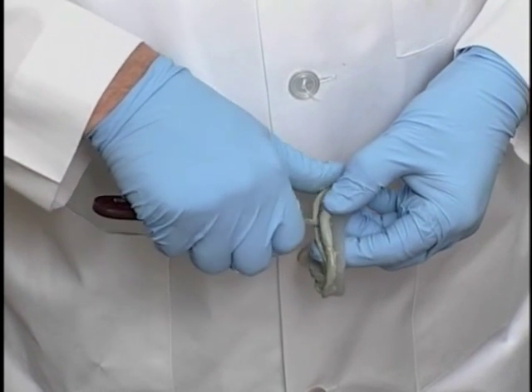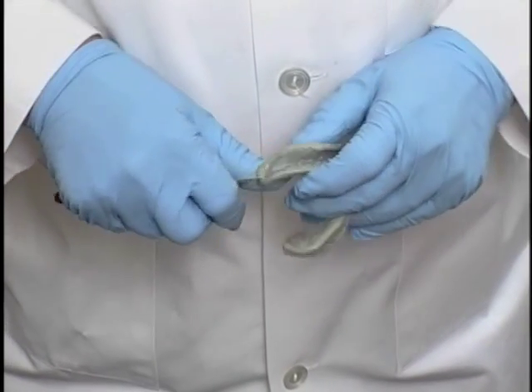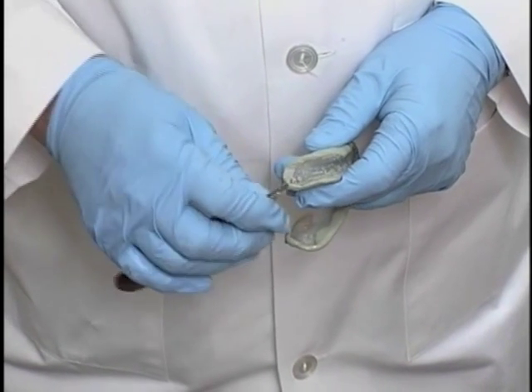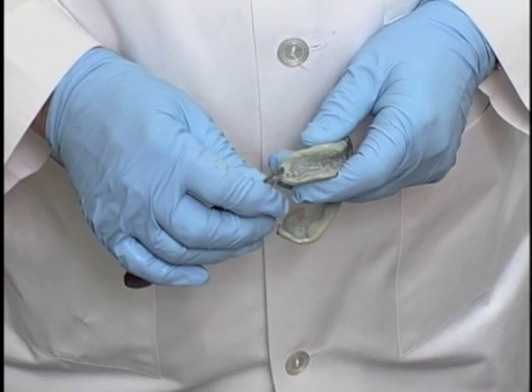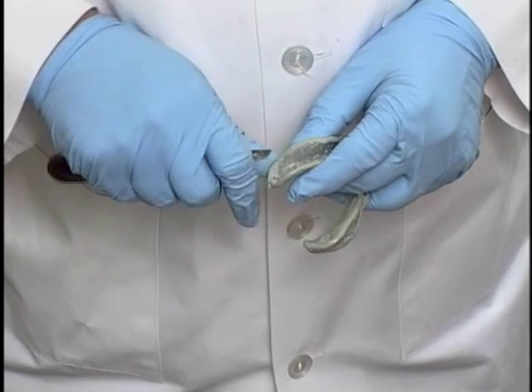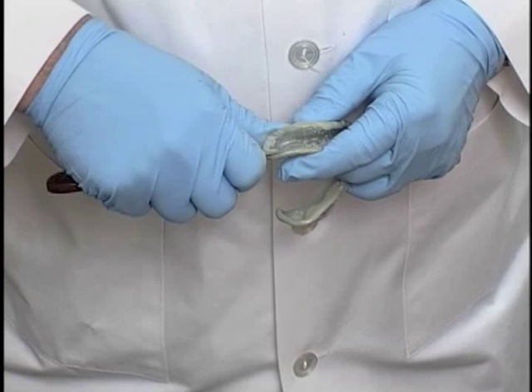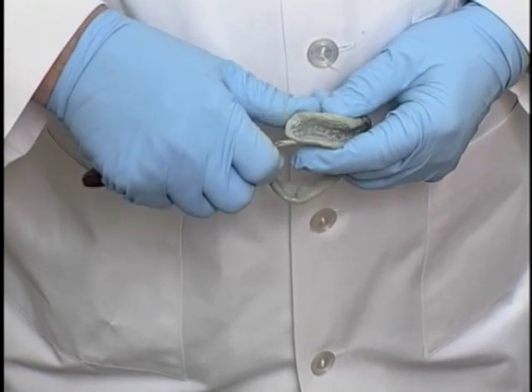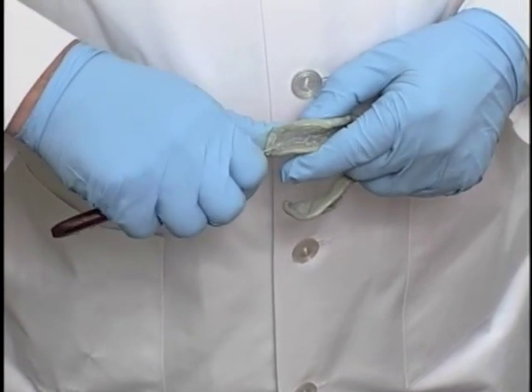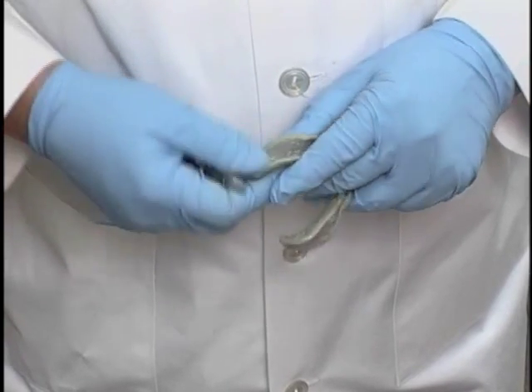And again, there's a little bit of it coming down on the inside of the tray right there, and again the retromolar pad. And in fact, if you happen to lose the little bit of retromolar pad peripheral molding by trimming this, that doesn't really matter. That will pick up quite nicely if you do lose some of that in the process of trimming it, without having to go back and reborder mold it. That's probably the only area that I would not go back and reborder mold, but that one you can. If you do lose it, it's of no consequence.